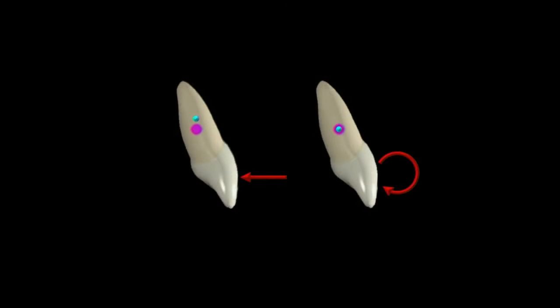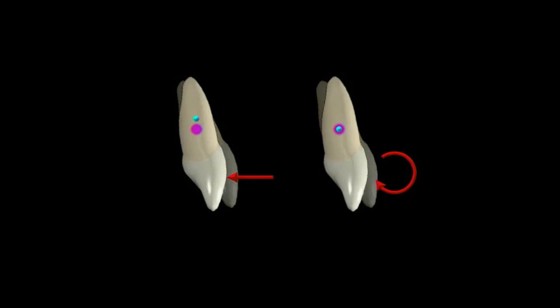As we've learned from the previous lecture, certainly the use of anterior crisscross elastic is not the method of choice for correction of midline. Therefore, we use couple instead. Single force at the crown or couple are totally different physical quantities. Even the units of each are different, but apparent tooth movements are very similar to each other. Hence, a couple can be used instead of a single force at the crown.